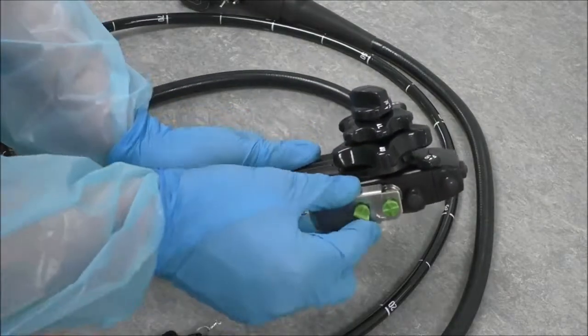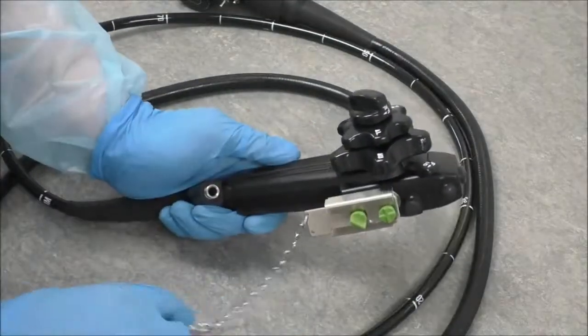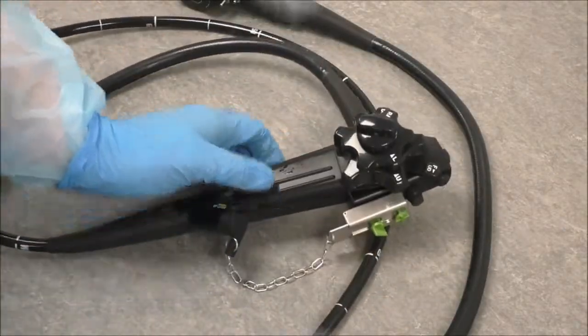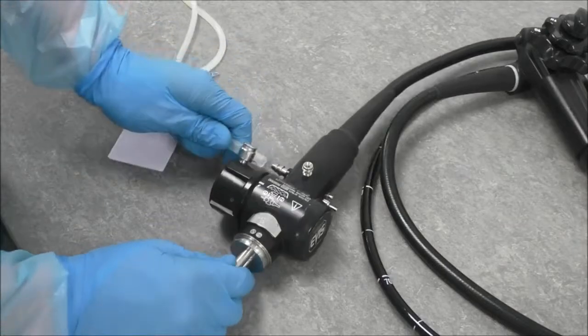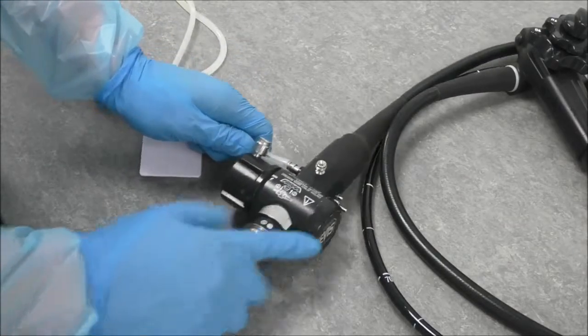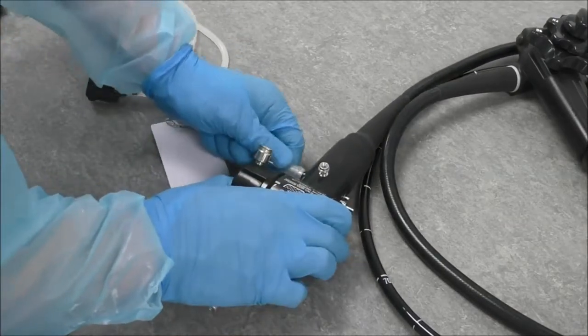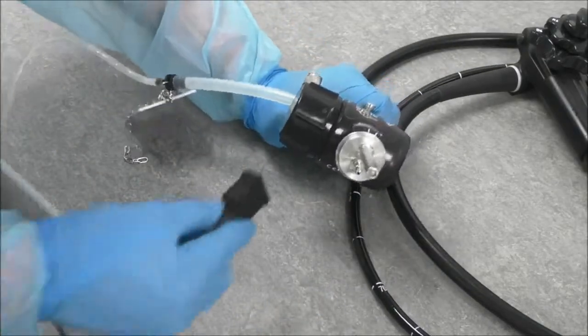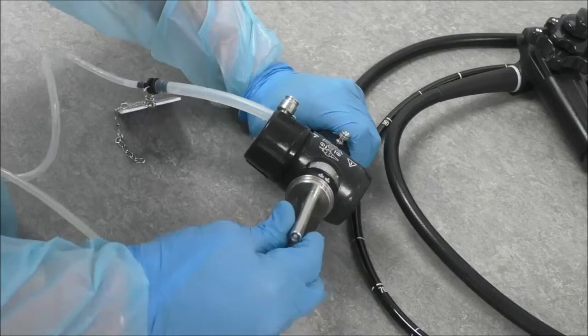Attach endoscope's channel cleaning plugs. Also, attach channel cleaning tubing and air-water channel cleaning tubing.